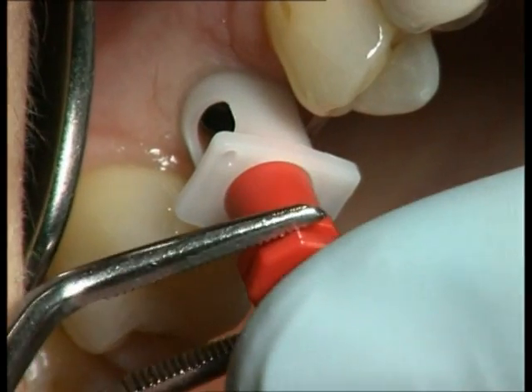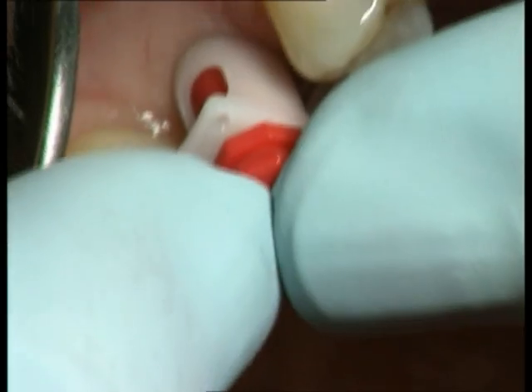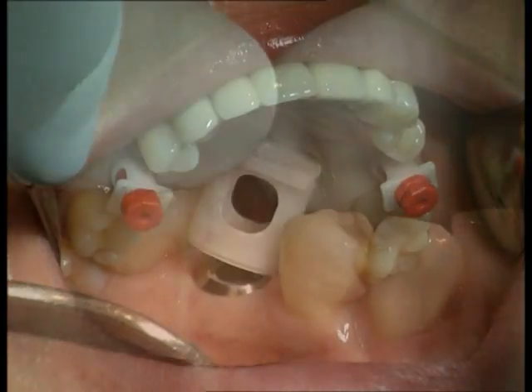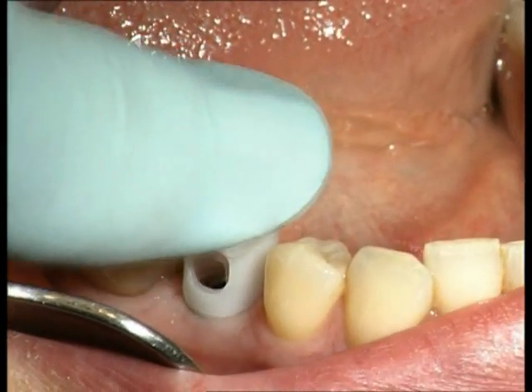Next, the positioning cylinder is aligned inside the impression coping and inserted as far as it will go. There should be no gaps between the impression coping and the positioning cylinder. The same procedure is used for the wide neck implant.